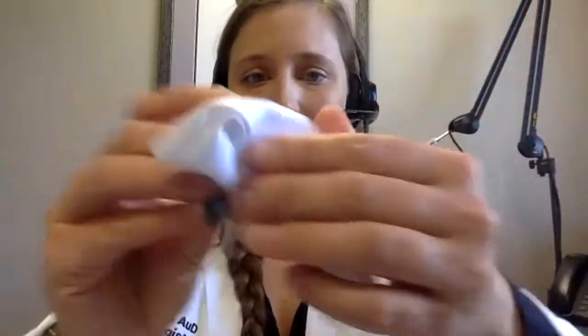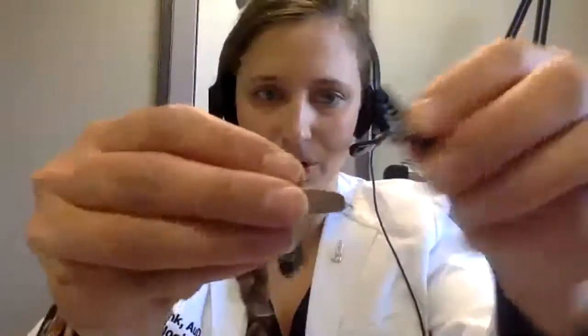Okay, so if you wear them in the shower, they get wet. That can happen. Always take your cloth, and as soon as it happens, wipe off everything. Again, use that brush. We're trying to get that moisture out of those ports. My dad put his hearing aids in rice. I don't recommend that, since the powder or film that's on the rice can get into those teeny tiny little microphones and get you plugged up. So we don't want to do that. Instead, brush them out, wipe it down. If you have a blow dryer, put that on the cool setting.